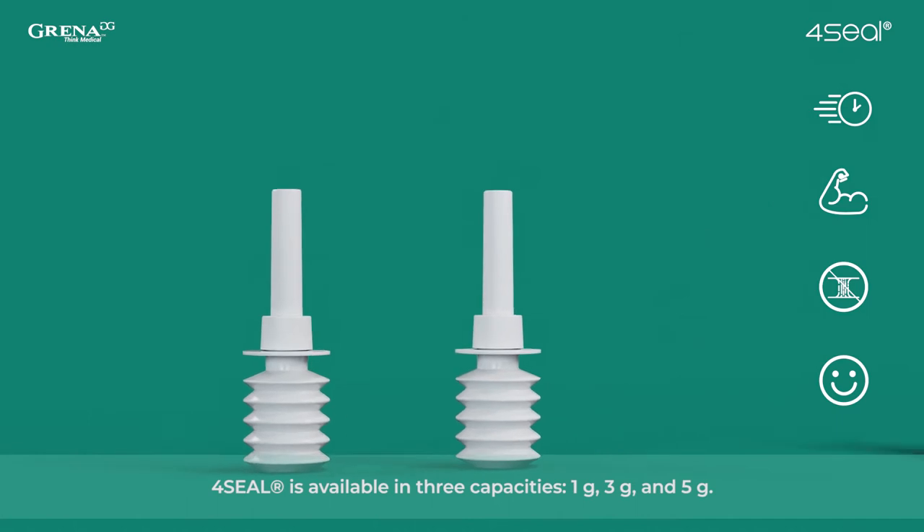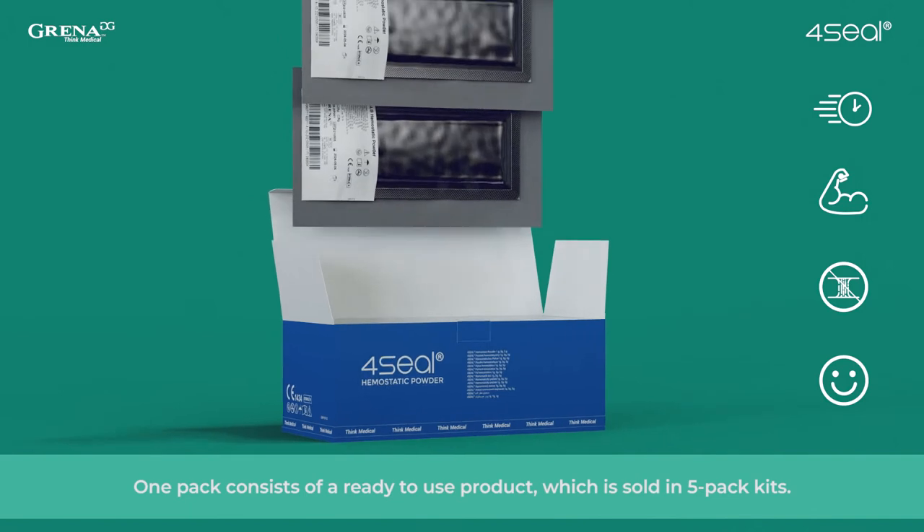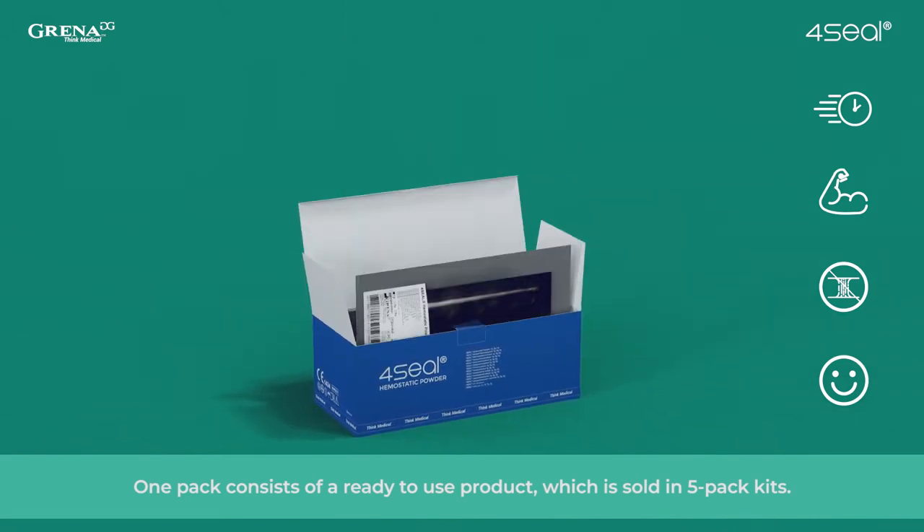Hemostasis is achieved within 2 to 3 minutes. 4Seal is available in 3 capacities: 1 gram, 3 grams, and 5 grams. One pack consists of a ready-to-use product, which is sold in 5-pack kits.